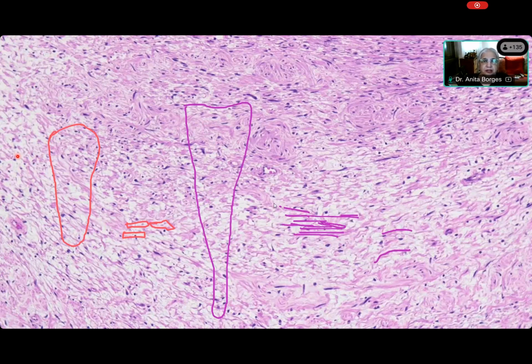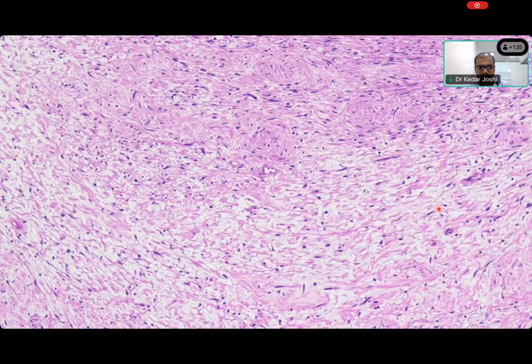Now, where's our friend Kedar? Do you understand, Kedar, what the carrot appearance is? Yes, ma'am. Yeah, and it is very typical. But I want you people please to look at these nuclei. This is a very classic case, but just look at these nuclei. Not only are they spindly, they are thin and long.